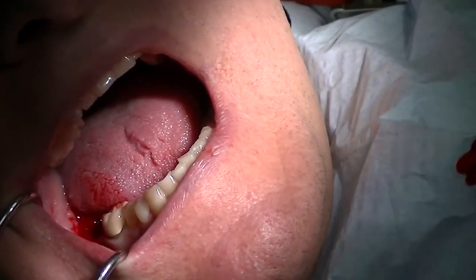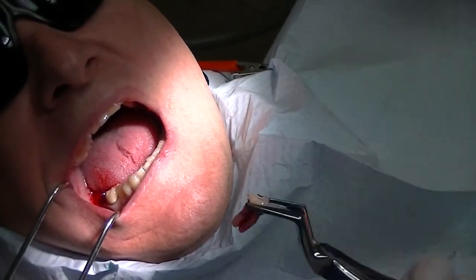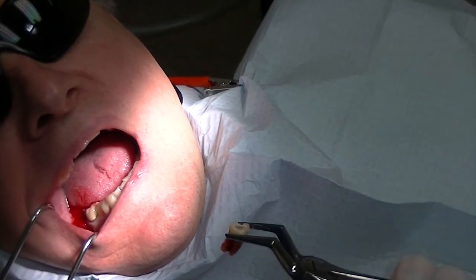And you can see the buccal plate is totally intact, and we're able to remove a difficult extraction very, very simply.